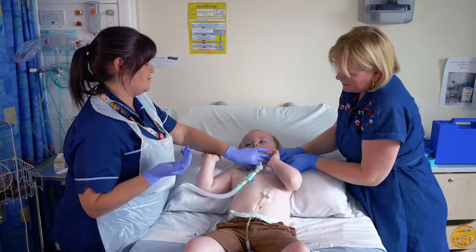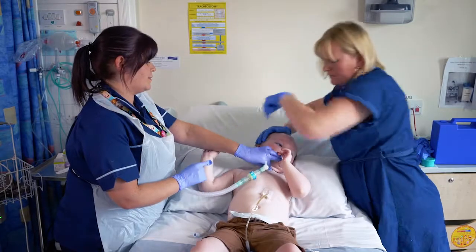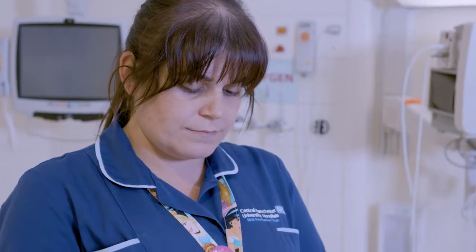Let's check it's not too tight. Check the side — you can check the side. That's okay. Let's check it out.